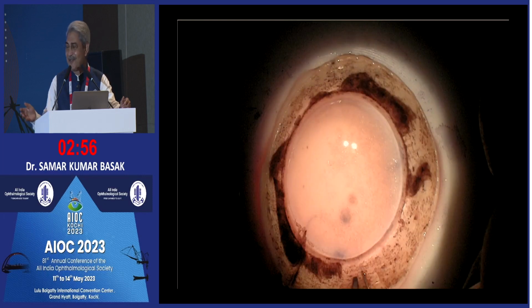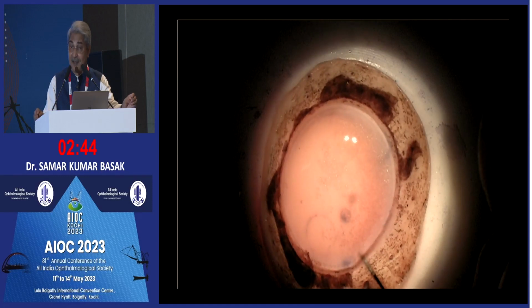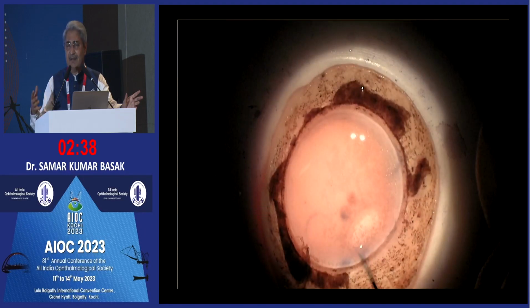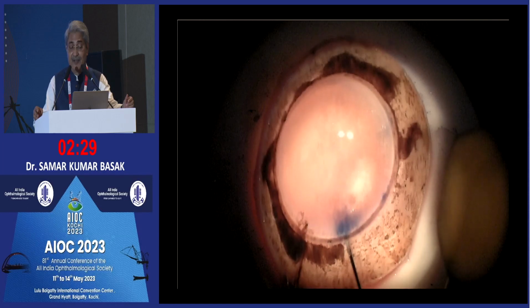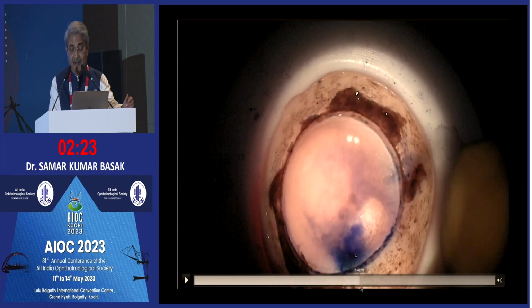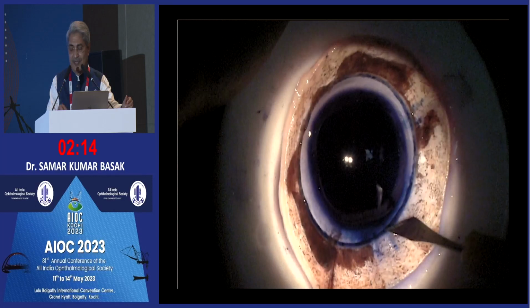This is the last one I have again learned from Rajesh. This is fluid based. I have not tried it, but Rajesh has told me you can do it in a younger donor, so that is very important. It's just like you are creating a big bubble on the posterior surface with fluid. Fluid means trypan blue dye, and you see that there is the creation of a bubble, and you have more zone. Now you puncture it and you just use it.